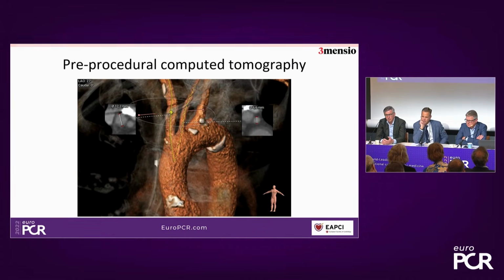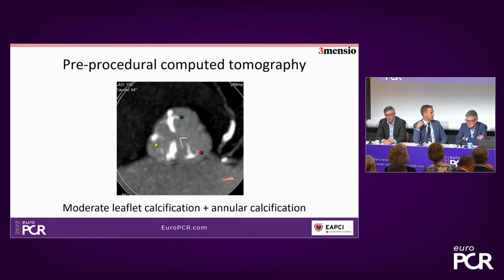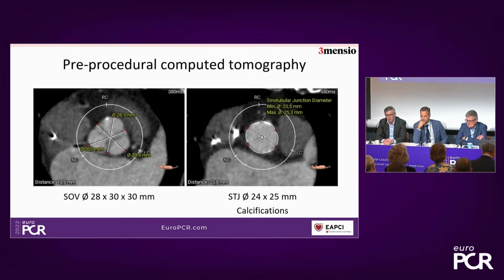We're going to use a protection device, and afterwards we go to the measurements, and it all seems like all the measurements actually fit perfectly in the Accurate Neo2 M valve. So okay. I think it should be.